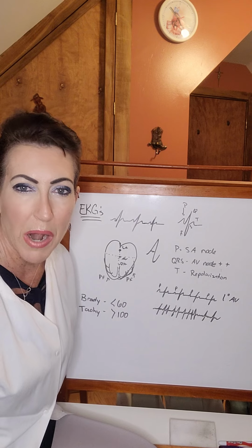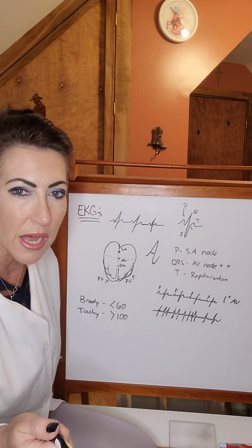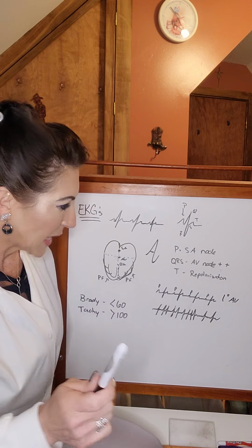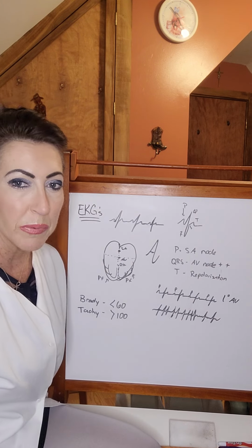And then, we can also probably go into a little detail with cardiac arrest. I need to do that. We need to talk about cardiac arrest versus an MI and how they're not always related. At any rate, so this is kind of the basics. So I drew a couple. So we've got the first degree AV block, super common.